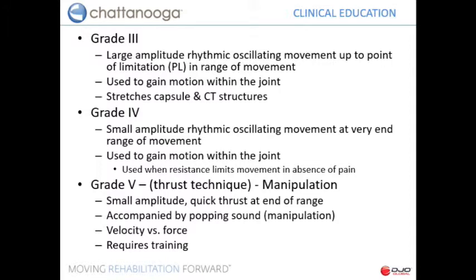It's at end range and uses a high degree of velocity, and it's usually a little bit more technical. So that one's not even replicated by our traction devices. At best, you're probably able to accomplish a grade 1, 2, 3, maybe even a grade 4 if you have the right device.